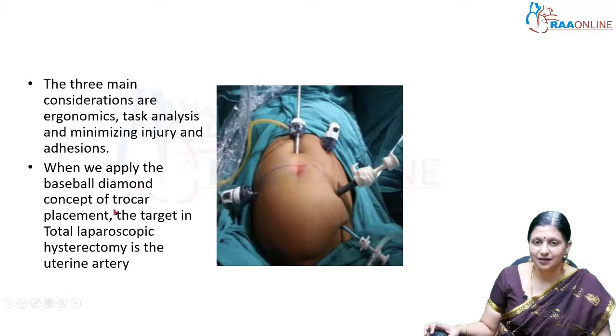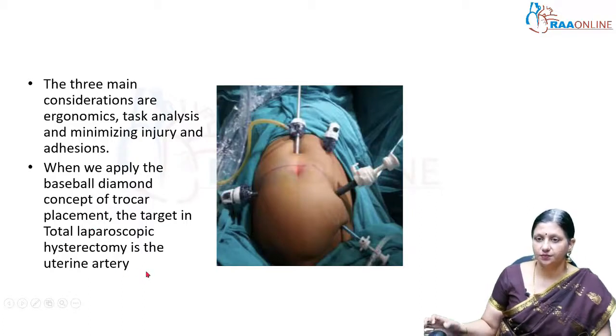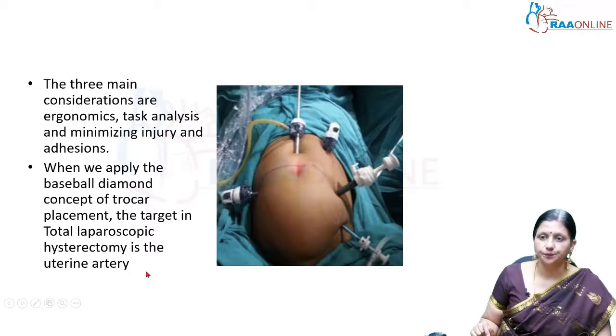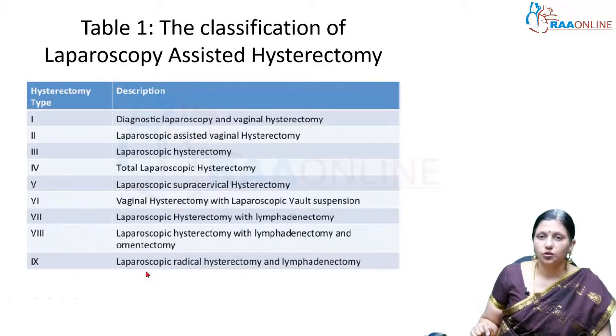When we apply the baseball diamond concept of trocar placement, the target in total laparoscopic hysterectomy is the uterine artery.